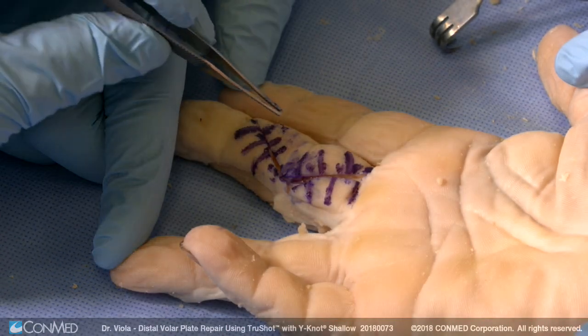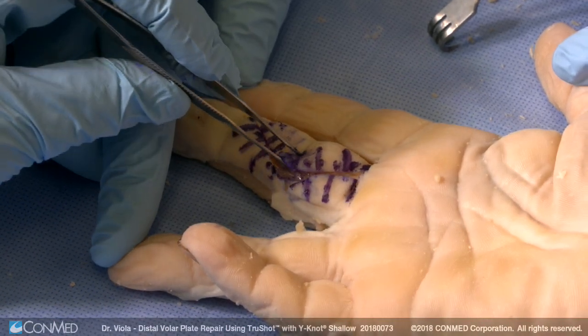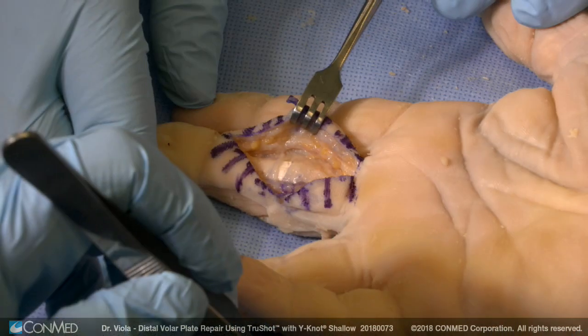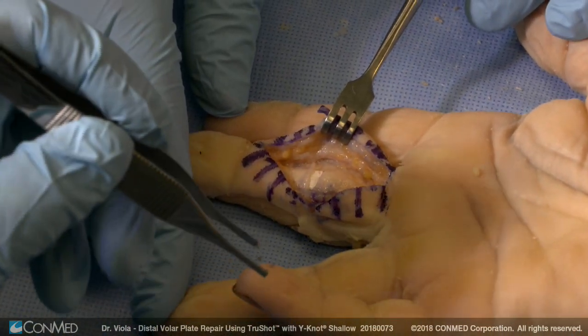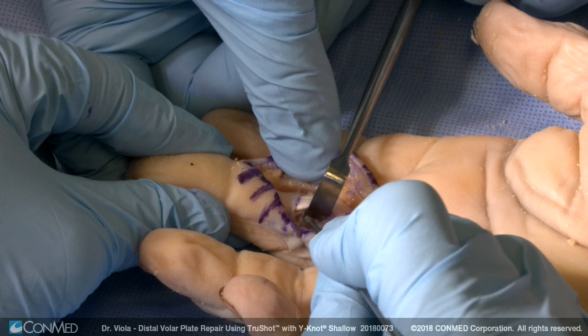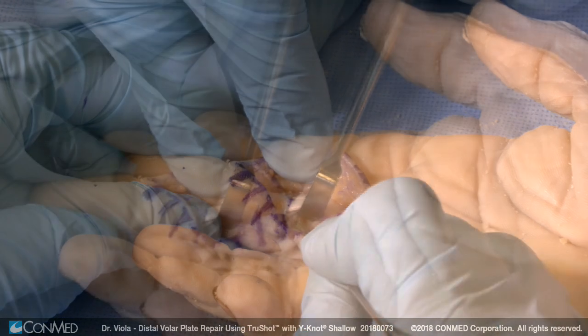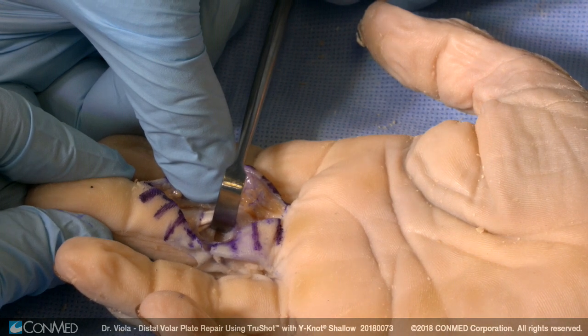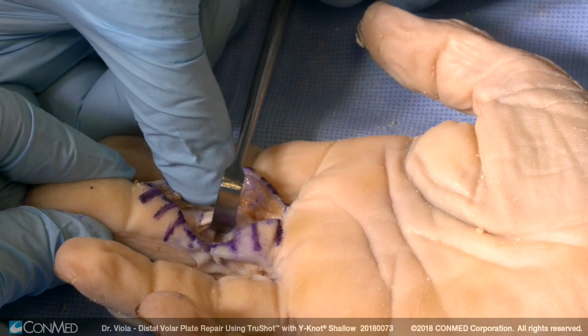We'll use a larger than normal Brunner approach in order to show the anatomy. We open the interval between the radial and ulnar neurovascular bundles. We expose the flexor sheath, which is opened in the window between the A2 and A4 pulleys. Here's the PIP joint. There's a small remnant of the volar plate distally — really nothing that you can suture. There's a large volar plate proximally that's torn and retracted. The finger has hyperextension locking, so we need an easy way to repair this.